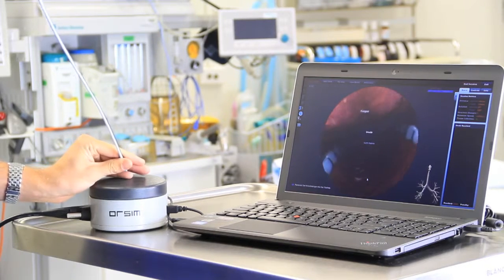It's realistic, it's fun to use, it's very portable, it has a range of difficult airways, and it prepares you for real life scenarios.